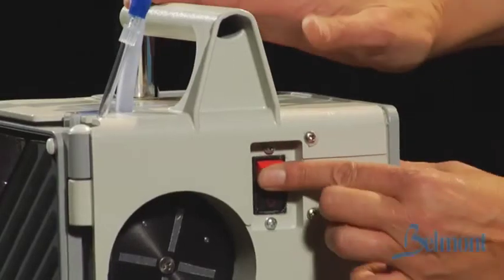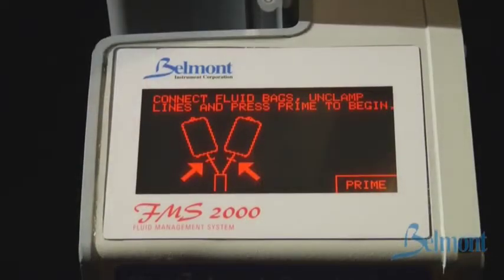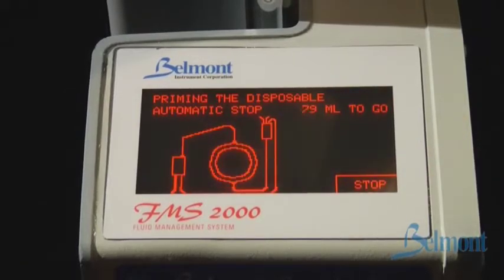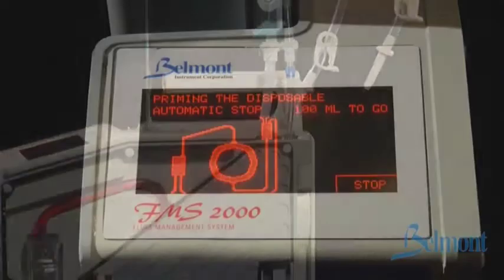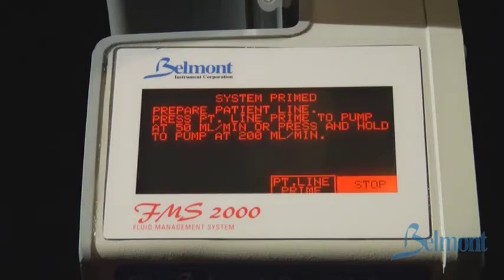Turn on the system by switching the power button to the on position. After a brief self-test, operational instructions are displayed on the screen. The first screen instructs you to connect the fluid bags, unclamp lines, and press prime to begin. The roller pump will automatically prime the system in about 13 seconds. Fluid is drawn through the tubing while the air is directed out through the recirculation or vent line. During prime, the 100 milliliters to go will count down to zero. If it does not count down or resets back to 100 milliliters, make sure there is enough fluid in the system and that the tubing is not stretched too tight.